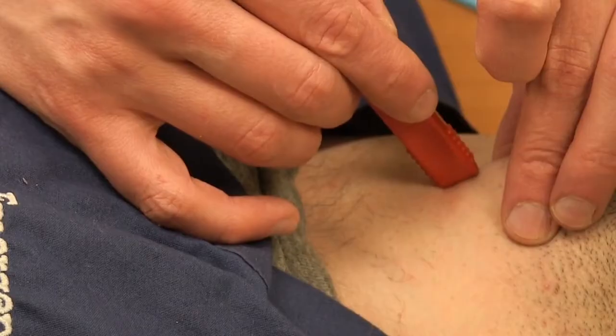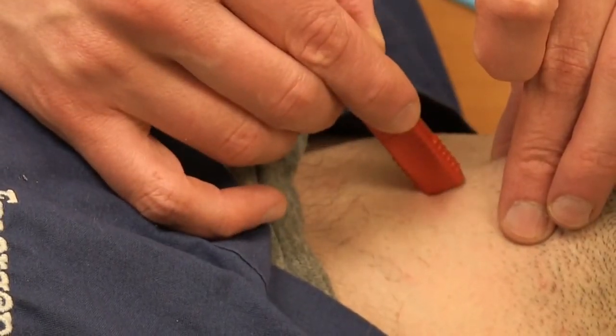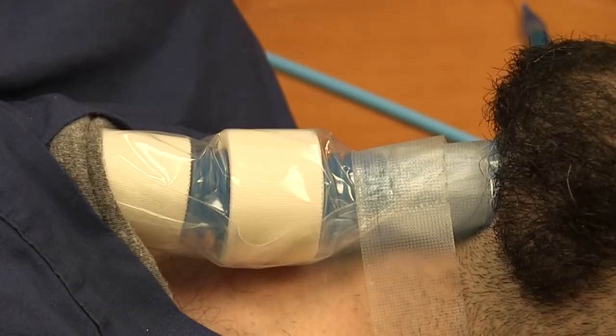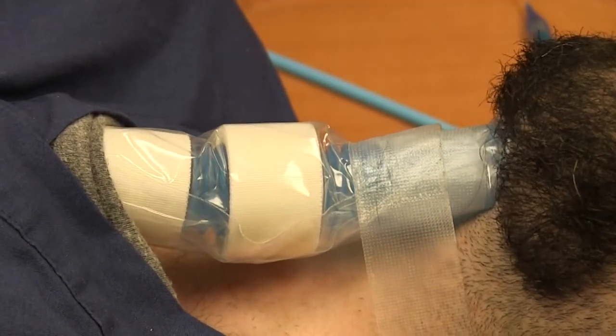This allows you to have very controlled movements — even though your hands are shaking from stress — without losing control of the scalpel.